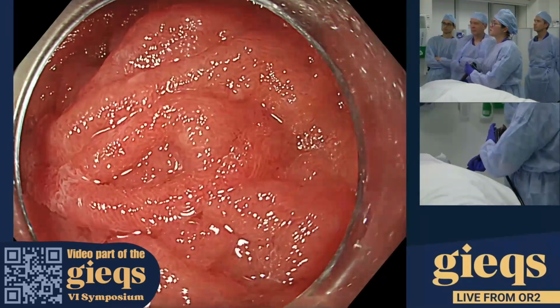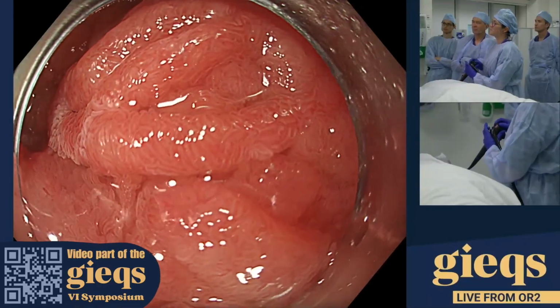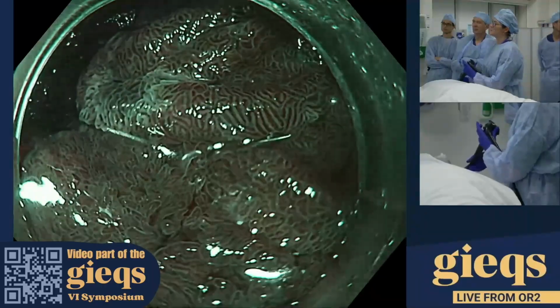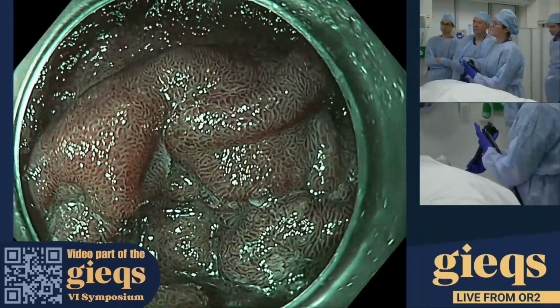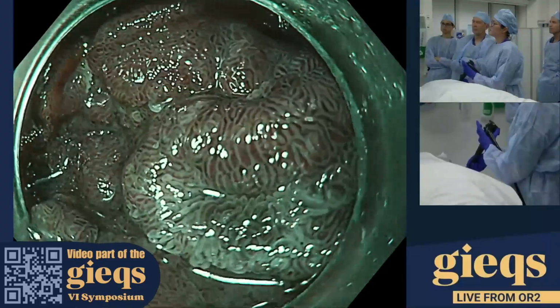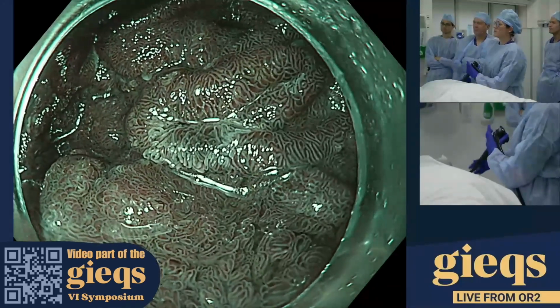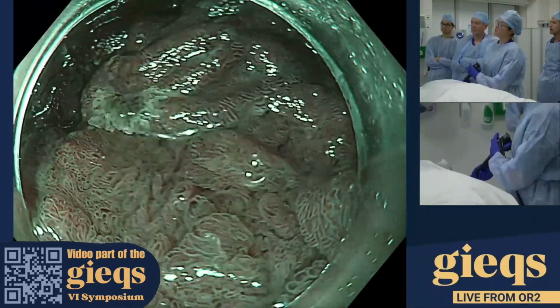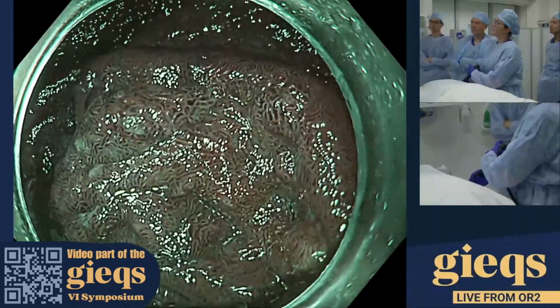I'm making small movements to get a little bit closer, not using my wheels too much, but just my wrist, trying to find the demarcation line, then go into the lesion. Try not to scrape too much with the cap over the mucosa because that can induce bleeding, and especially when you're using virtual chromo, that can really mess up your image.